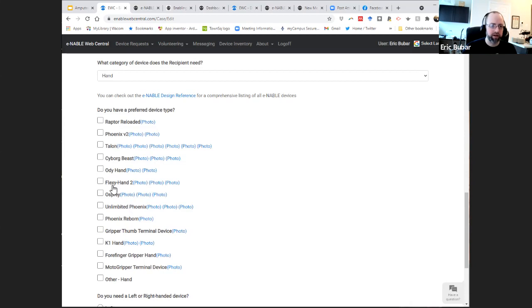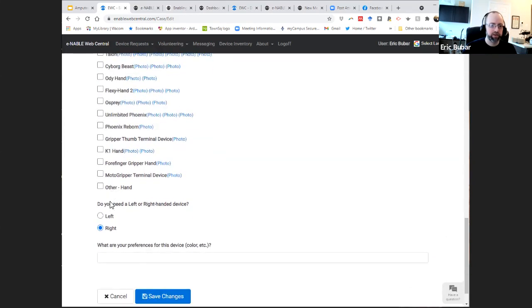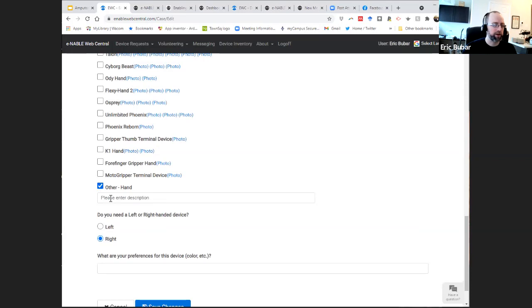Most of these, I believe, are set up for hands, but you can mark this other and describe what you would want. So you would be able to describe, I want something to help me with my ponytail. I need a full arm. And we could get started with matching you up with somebody that could help you to get that.